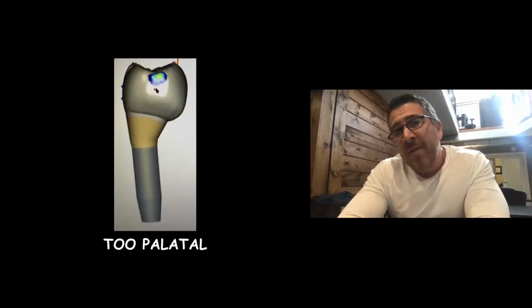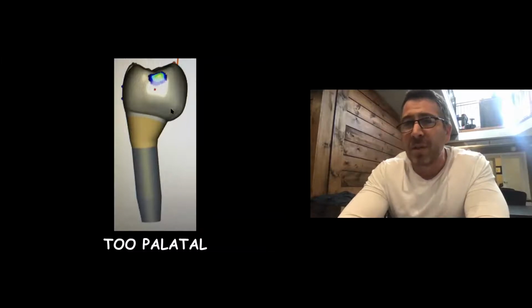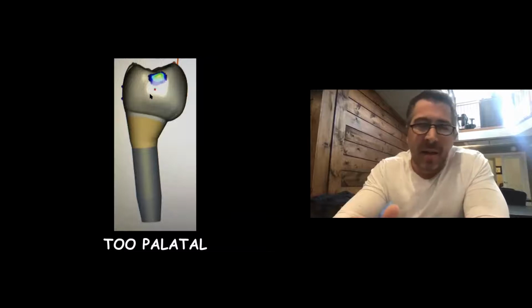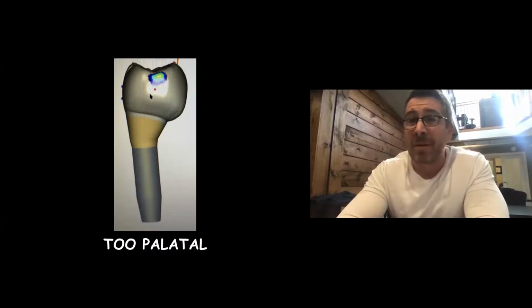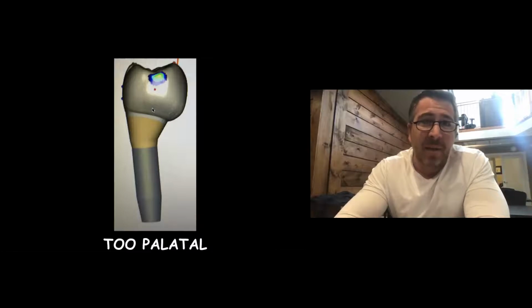If things are too palatal, well, now we end up talking about two things. We can talk aesthetics, where we're going to have too much tissue and an over-contoured crown. And now you can talk about the issue of non-axial loading, and whether or not that's a real huge issue in a single tooth restoration. It's a relative conversation, depending on how palatal and how off angle you're talking. But in my opinion, a single implant in this kind of scenario is not so off angle that the mechanical issues are going to be a problem.